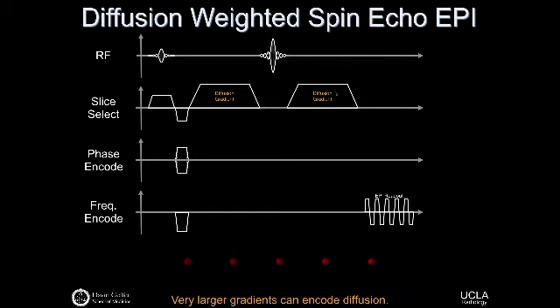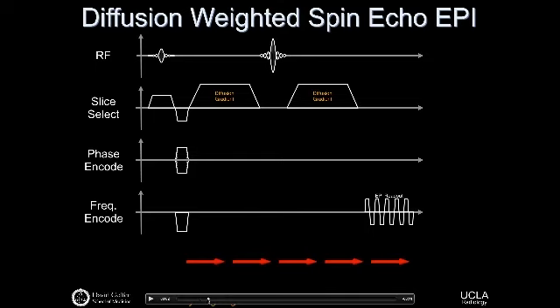And it may not be obvious in any clear way, but the addition of a really large gradient like this gives us sensitivity to how freely water diffuses inside different tissues. And the idea is something like this movie that's on the bottom here. Let me walk you through it. And so these are spins. They're all pointing out at us. And we hit it with a 90-degree pulse, and they tip over into the transverse plane. That's that part we're familiar with already.